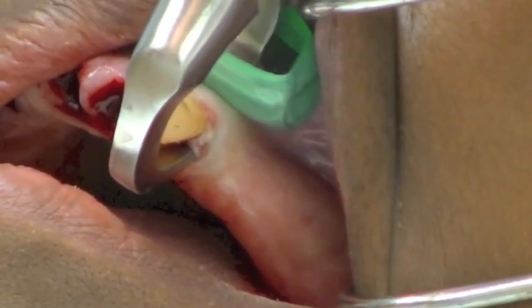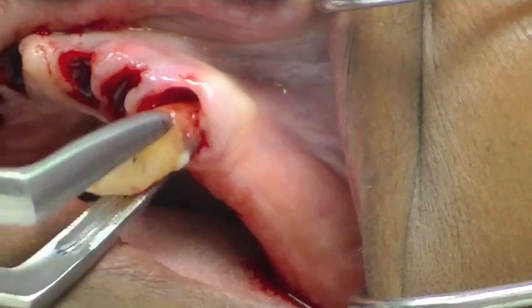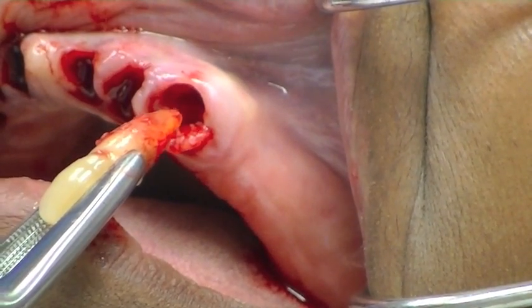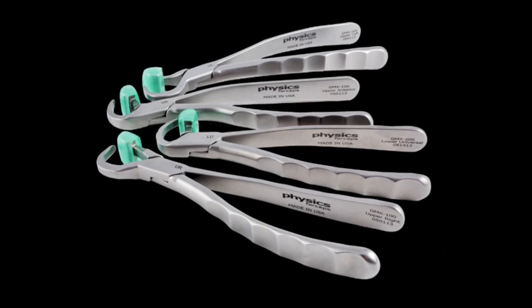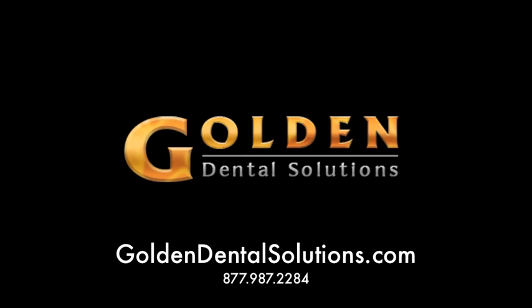At this point, you have achieved an atraumatic extraction site, which is a great foundation for grafting and implant placement. For more information on the physics forceps and the Vibroject Injection System, please visit GoldenDentalSolutions.com or call 877-987-2284.